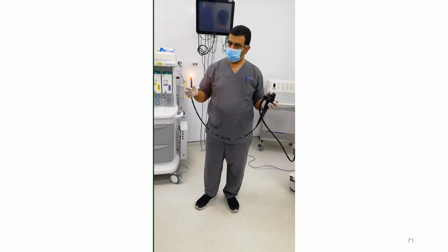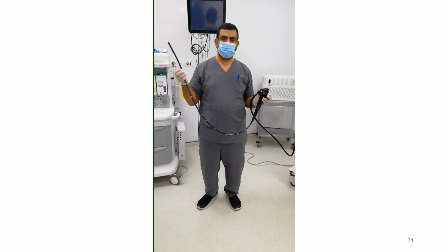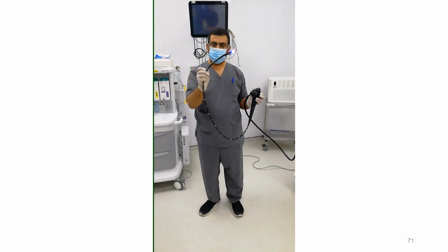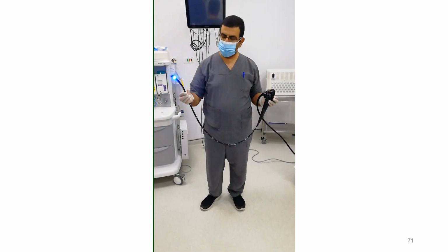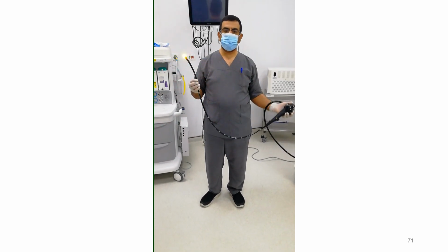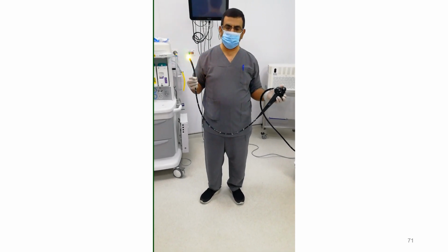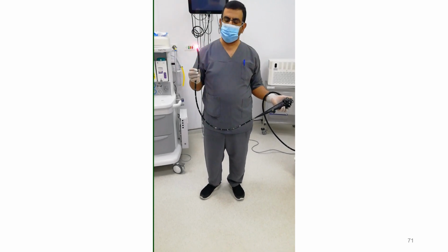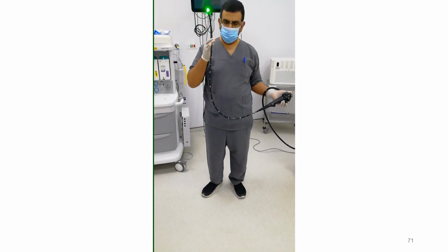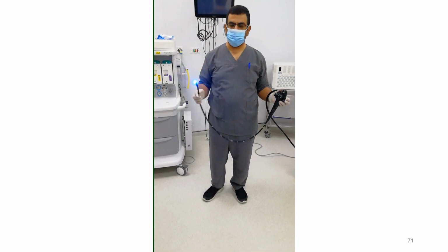أنا مجرد ما دخلت الإسوفجاس، طبعا حضراتكم عارفين إن الأبر إسوفجيال سفنكتر بيكون موجود على بعد 20 سم من الإنسايزرز بتاعت العيان. ومجرد ما عديتها برمي إيدي شمال. يبقى القاعدة الأساسية في الإسوفجاس: لما تخش في الإسوفجاس ارمي دراعك شمال بدون رايت ولا ليفت، هتلاقي المنظار بتاعك ماشي في نص الإسوفجاس بالظبط.